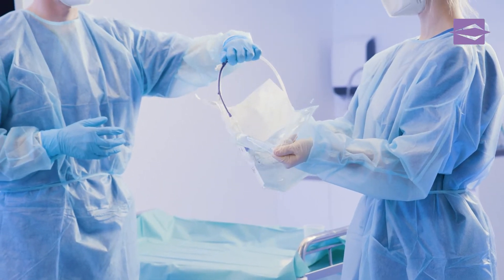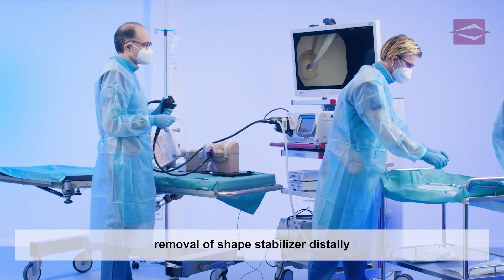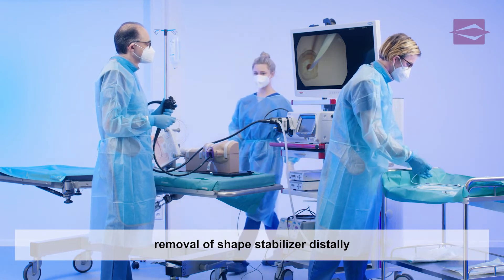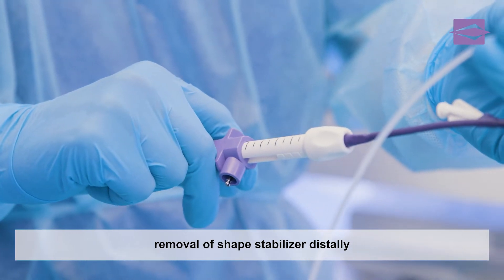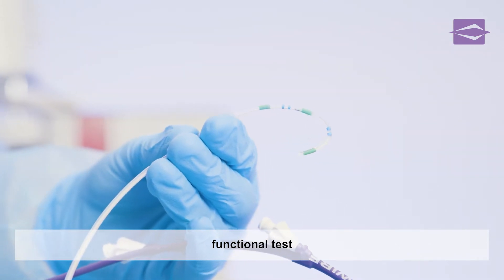After data comparison, the sphincterotome is removed from the sterile packaging by the assistant. Before application, the assistant pulls out the shape stabilizer, which is integrated in the tip of the sphincterotome. This is followed by a mechanical function test.